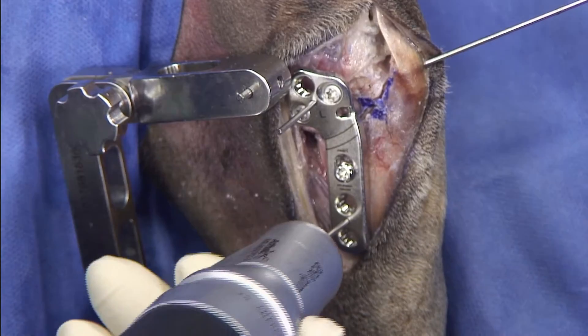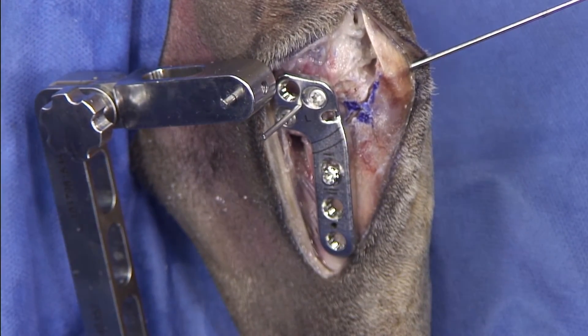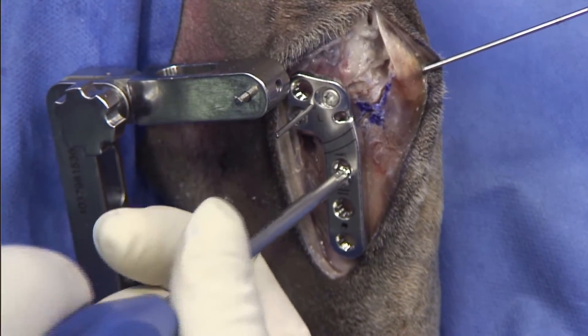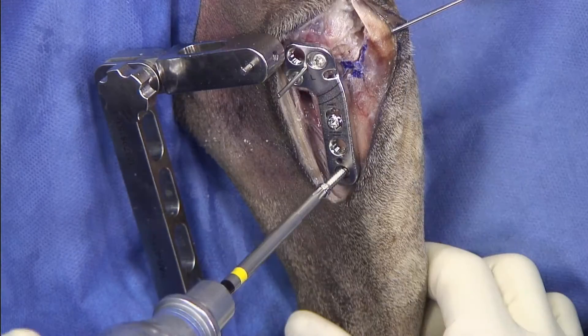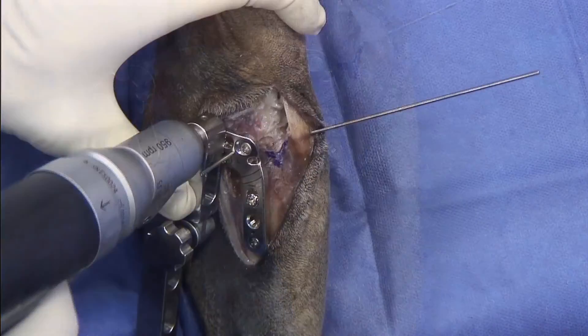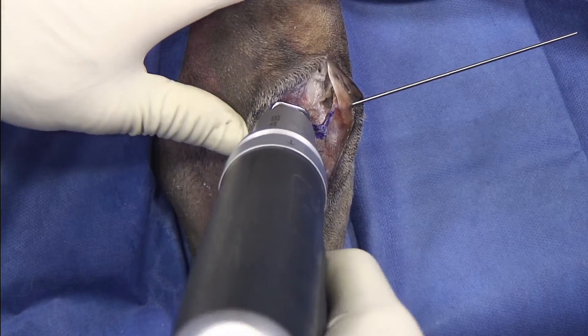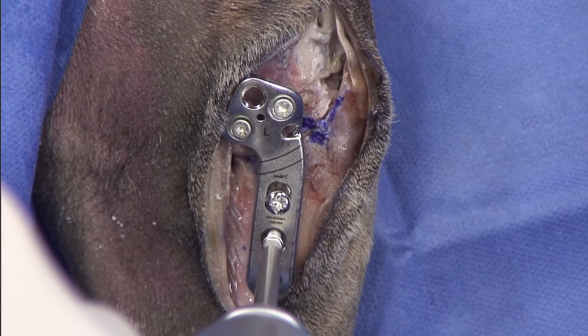The next step for me now is to remove the distal K-wire and then tighten down the compression screw. I'm measuring right now 14, so I would go with an 18. Now we're ready to remove the jig, remove the K-wire, and place the last 2 screws.